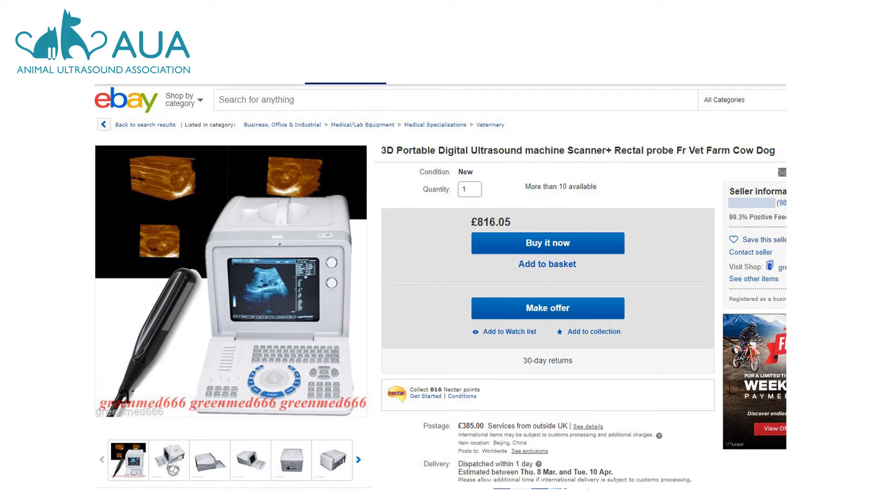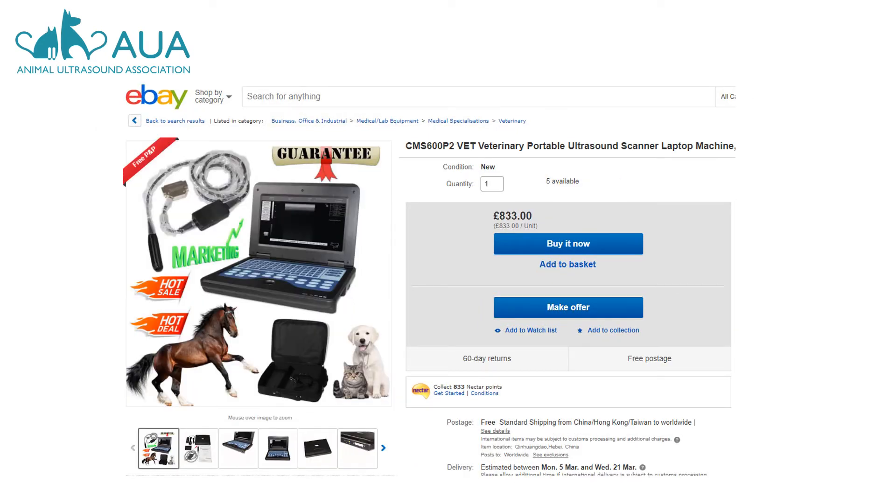Are you really going to be scanning your dog rectally? I sincerely hope not. Here's another example of what comes up when you search for veterinary ultrasound on eBay. At least the previous listing declared in the title that it was equipped with a rectal probe, despite the fact that saying it was suitable for canine scanning was somewhat bewildering.